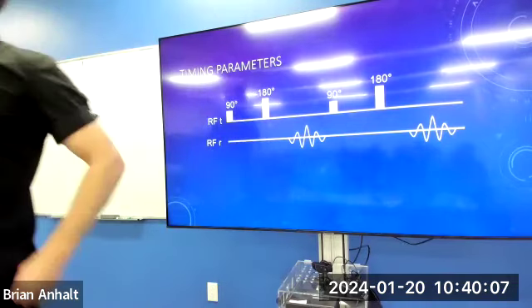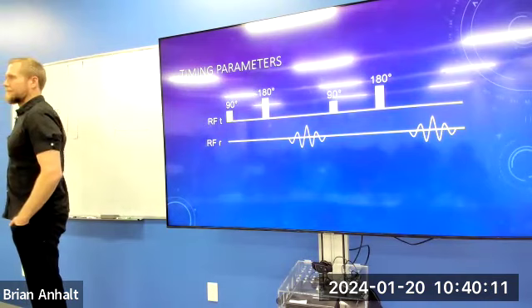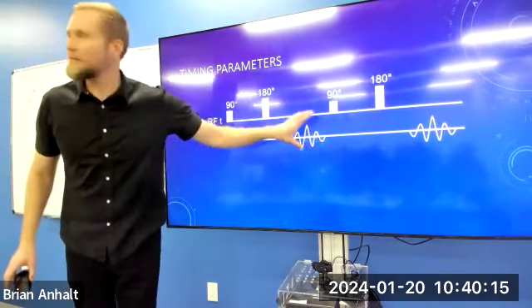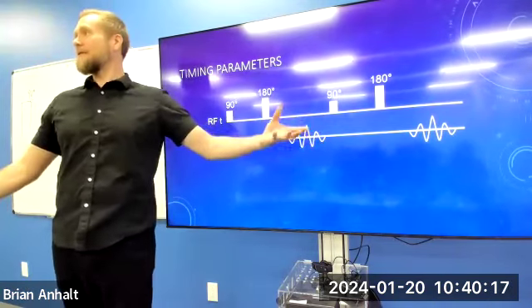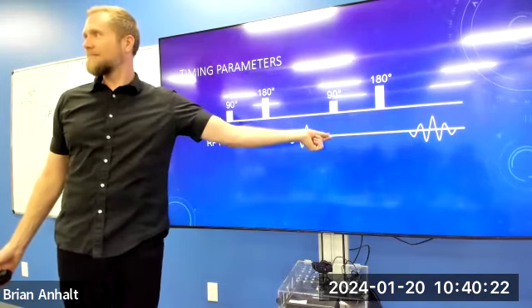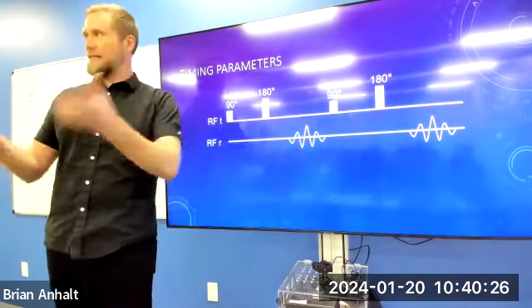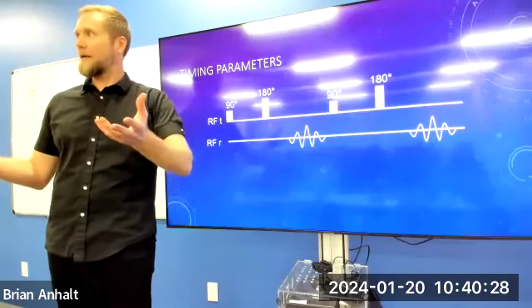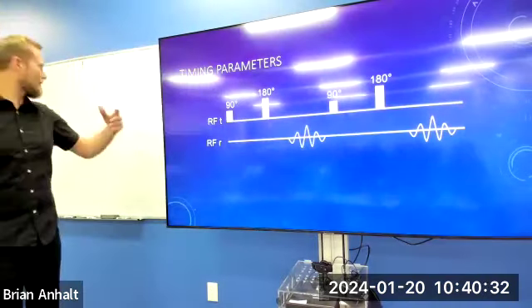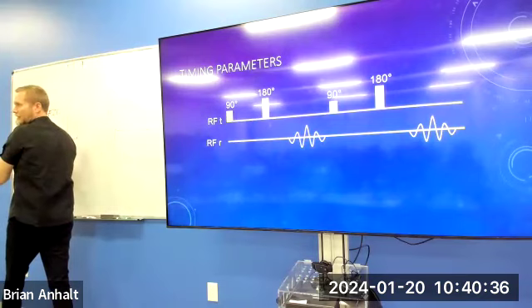All right, yes. So the free induction decay only happens after the 90 degrees? Yep. I mean, if you're looking at the echo dephases, it's not called the FID, right? But it's happening at the same T2 star rate. The rate it comes back into phase and dephases again on every echo is that T2 star decay rate. But yes, the FID is only the first thing that happens. It's this free induction decay right after the 90.